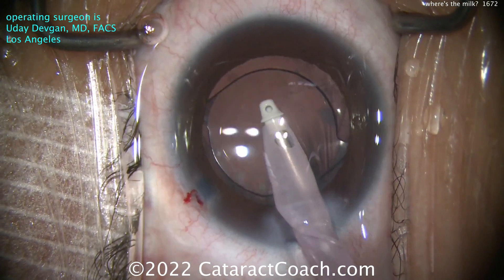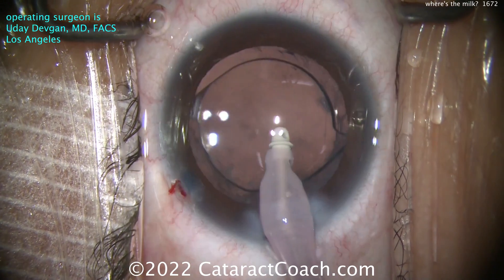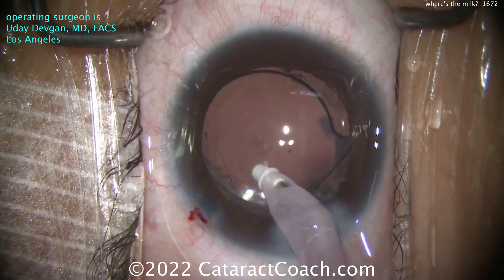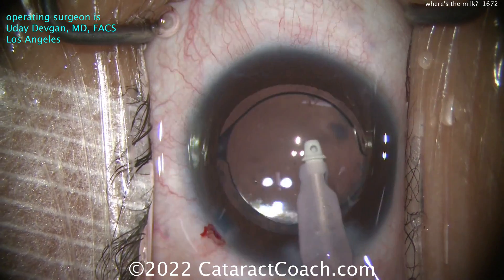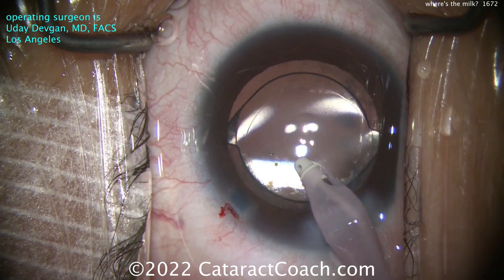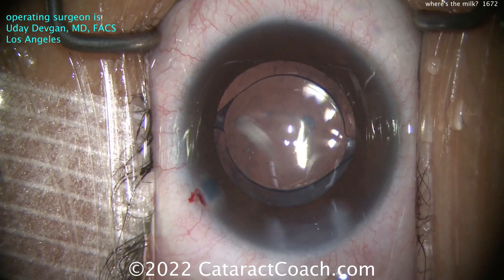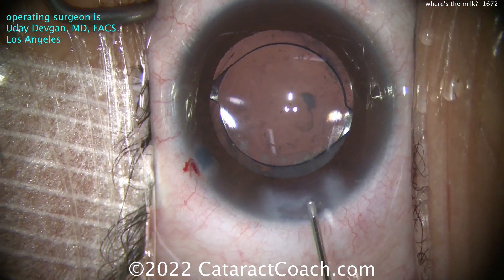At the end here, cleaning up the rest of the case pretty normally. Keep in mind - not all white cataracts are the same. If they have a whitish to bluish tint, those are more likely to have liquefied lens cortex. If they're whitish and you see a dark periphery, like in this case, or you can see the yellowness of the nucleus, then they may be more of a solid or dense white cataract with minimal or no intumescent fluid - like in this case.